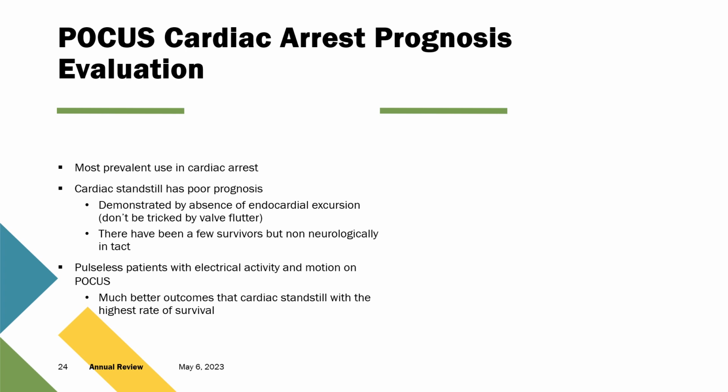Now, don't be confused if there's a little bit of valve flutter, as that could just be flow from one part of the heart to the other without contraction. Make sure that you're not confusing that with true cardiac contraction. So you're watching the muscles here and making sure that there is no cardiac contraction. There have been very, very few survivors among patients brought back after cardiac standstill, and of all the survivors that are documented, none of them have been neurologically intact.